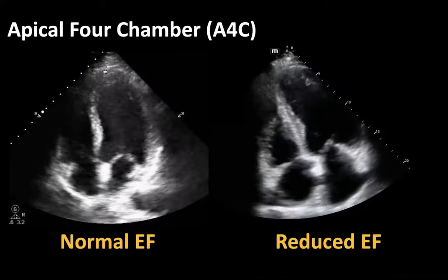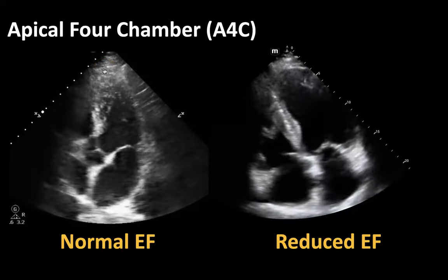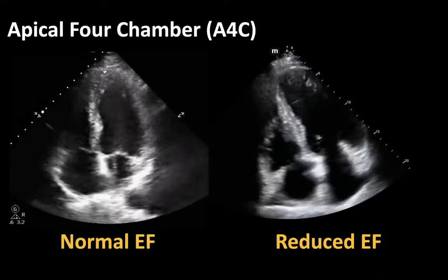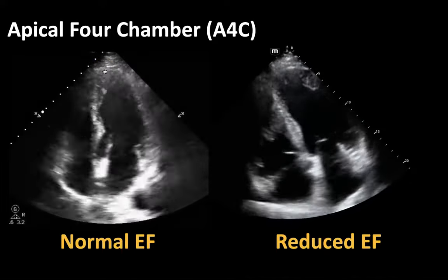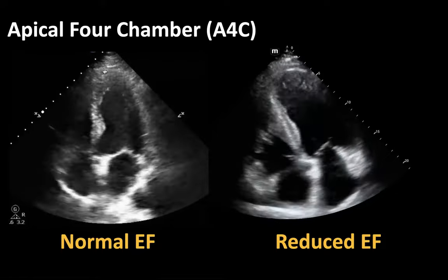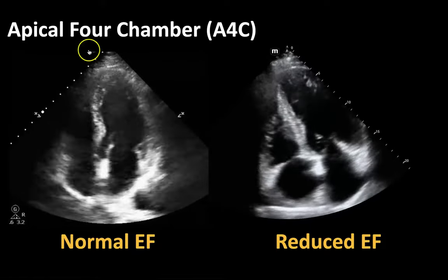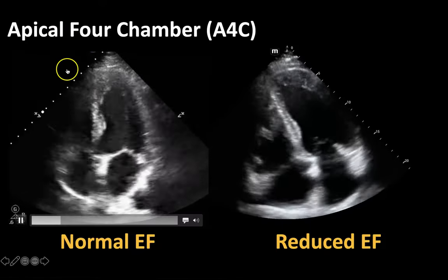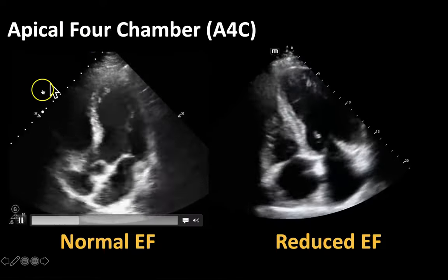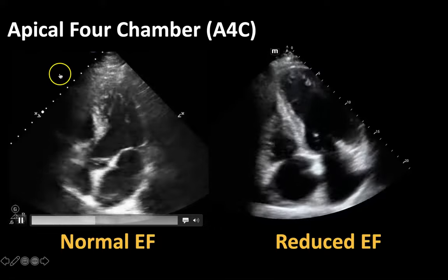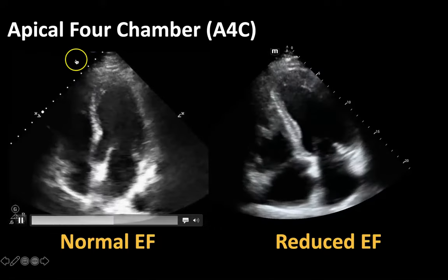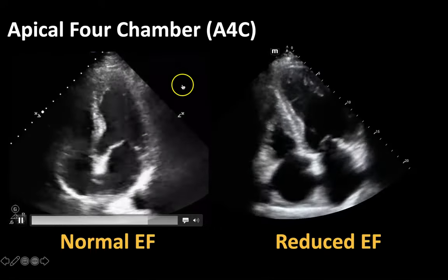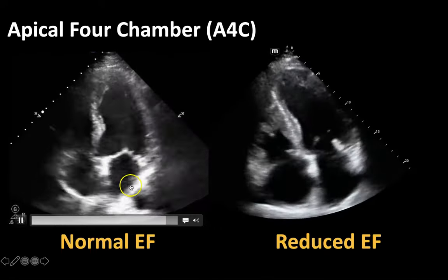So now let's look at your apical four chamber view. This is where you put your probe at the apex of the heart, and your probe marker is going to be facing towards the patient's right, which is standard convention.